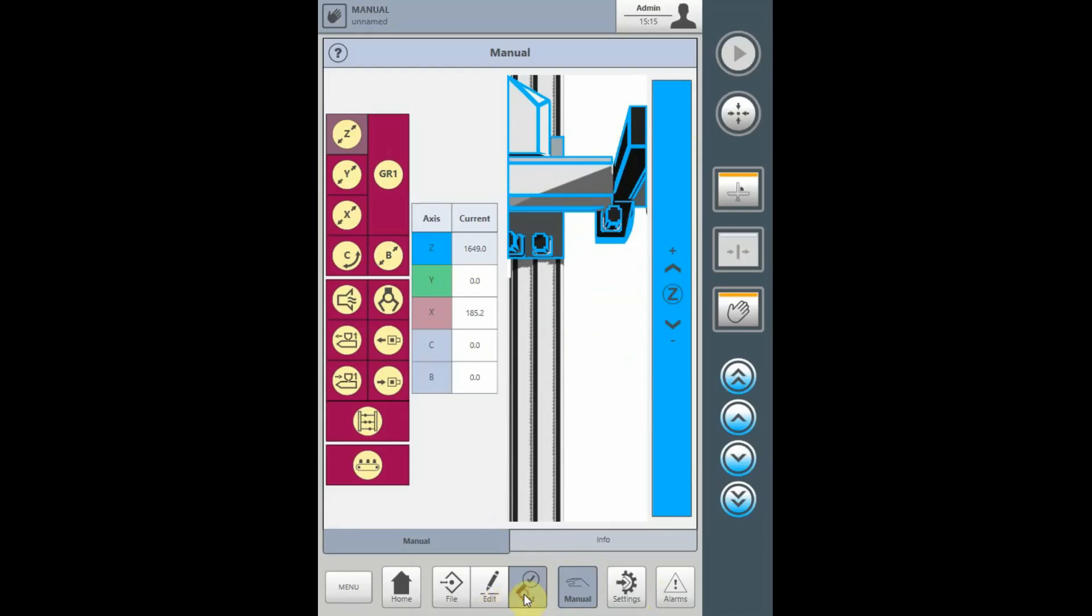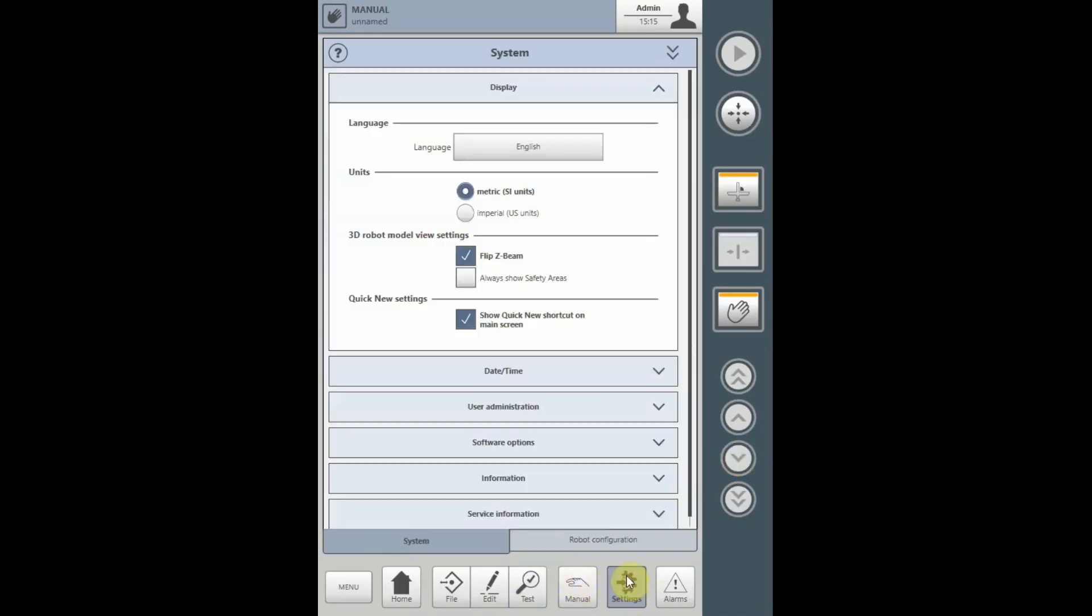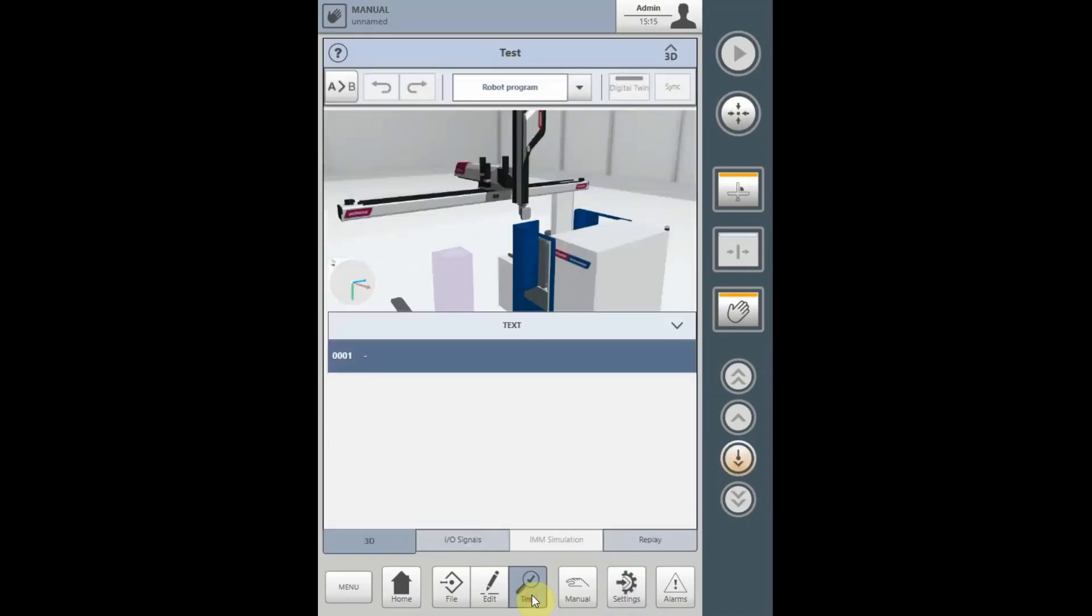In the 3D scene, if you want to show any safety areas that are currently in the program, select the Settings tab, Display, and check Always Show Safety Areas. When you look at the 3D scene, you will see the safety areas available in the 3D scene.